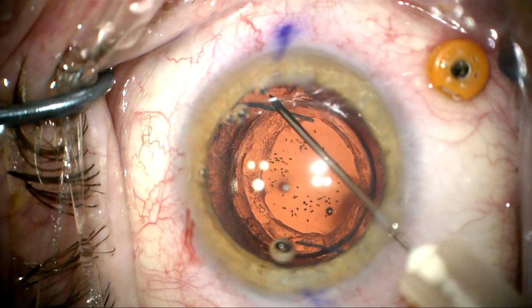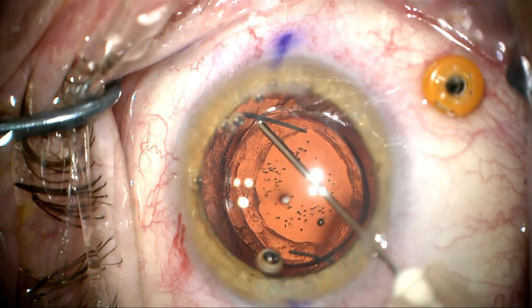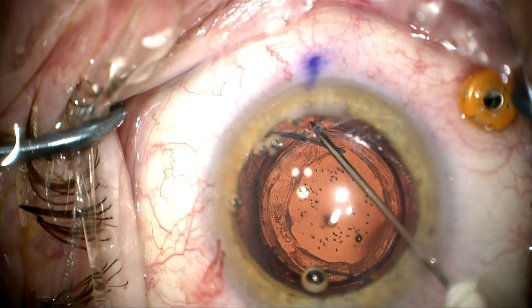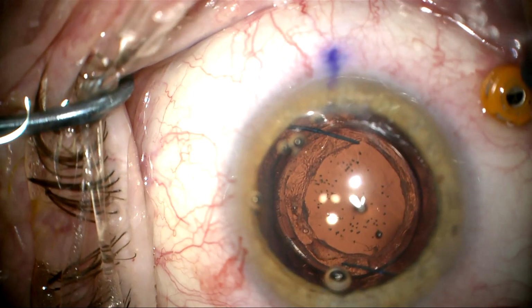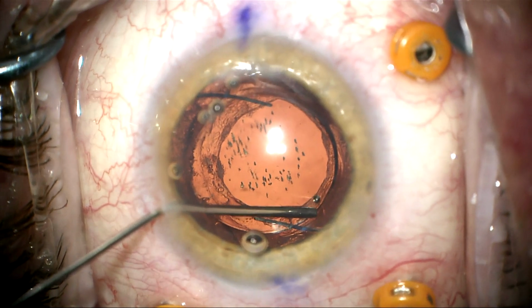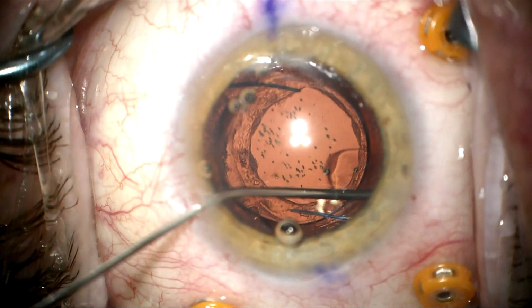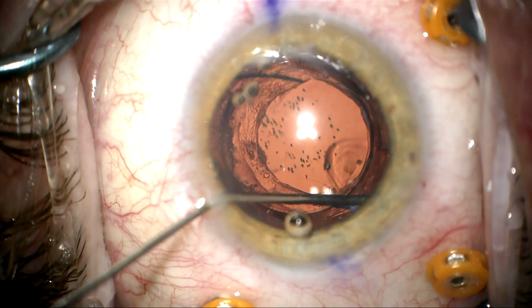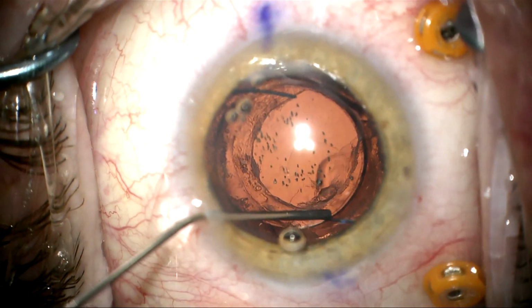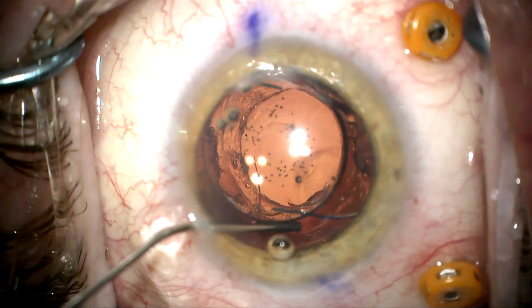Here you can see this is where the anterior and posterior capsule are fused. And I'm trying to separate this a little bit using the 30 gauge needle, but I want to be careful not to damage the posterior capsule as I do this. I'm now going to try to enter with a viscoelastic cannula, and as I push down on the haptic, I can enter in and get some viscoelastic into that space and start to separate the anterior and posterior capsule here.